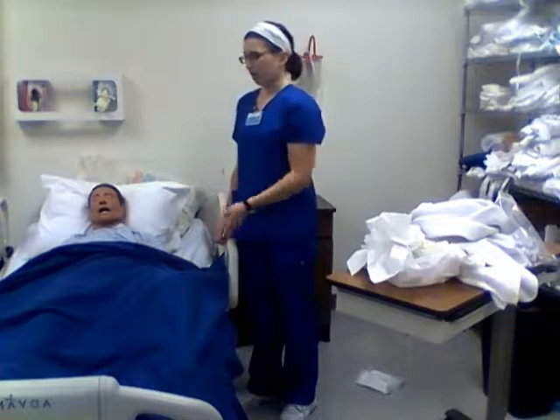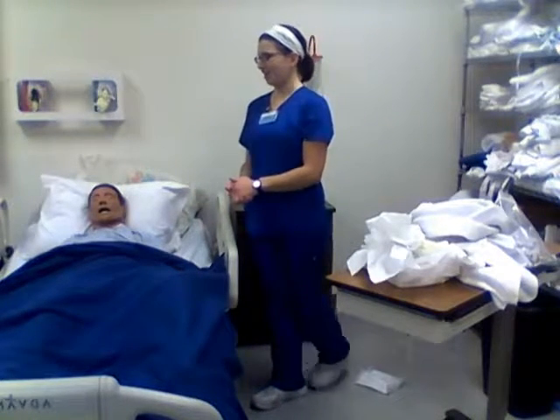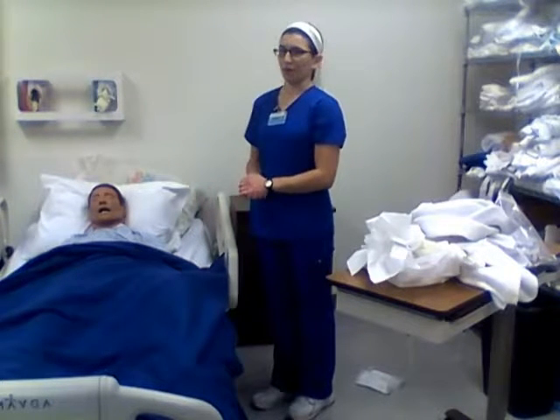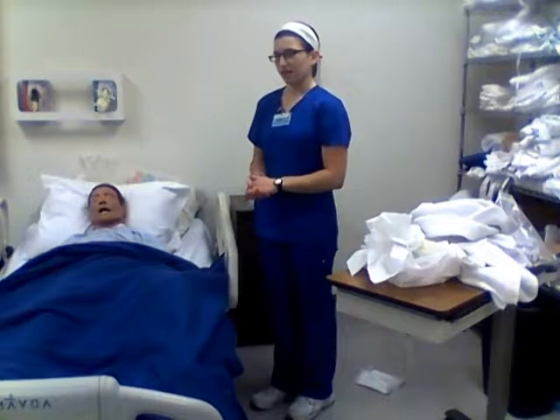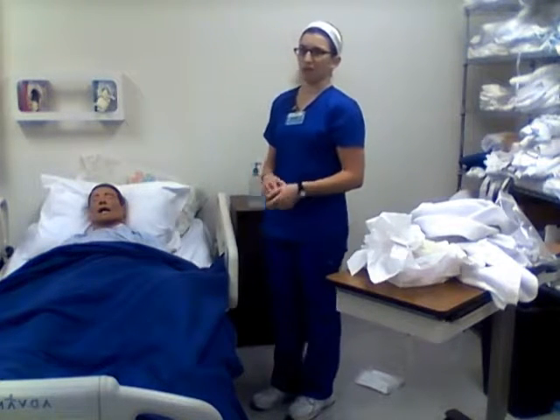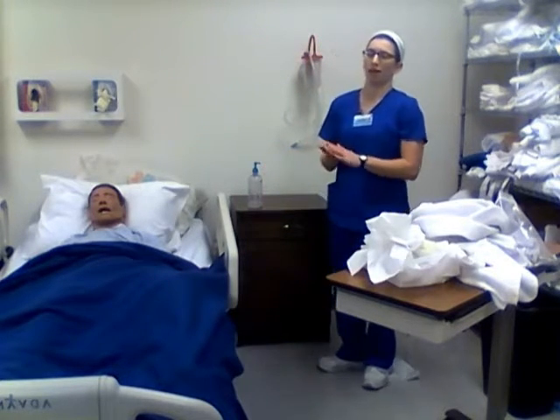And before I leave the room, I'm going to ask her if she needs anything. So, ma'am, do you need anything? And she says no. So I can go ahead and I'm going to document this. I'm going to document the time, what I did, anything that could have gone wrong, like any kind of complications at all. And so now I can go ahead, before I leave the room, I'm going to once again do a check of the room, assess everything, and then before leaving, I'm going to perform hand hygiene.